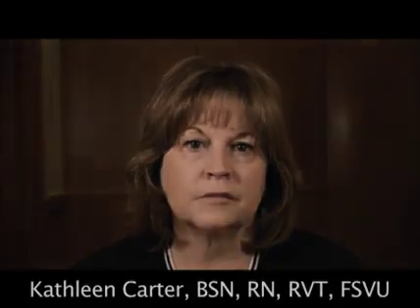I'm Kathleen Carter, RN, RVT. I'm a vascular sonographer. I live and work in Norfolk, Virginia, affiliated with Eastern Virginia Medical School. And I'm going to talk to you today about abdominal ultrasound, specifically the aorta and mesenteric systems.